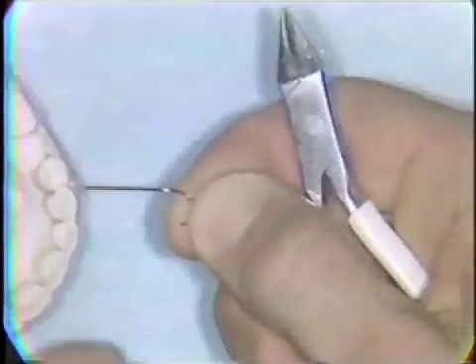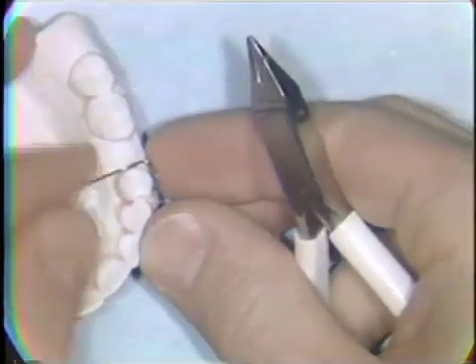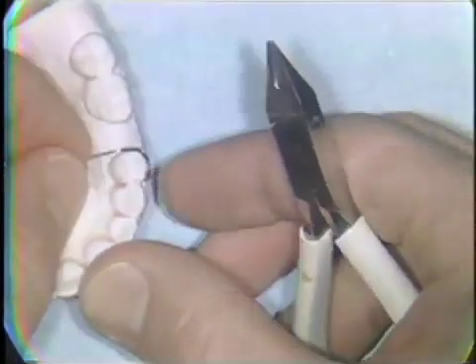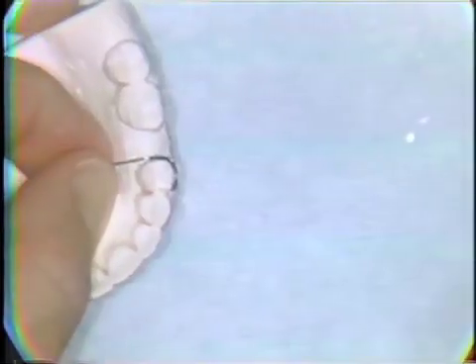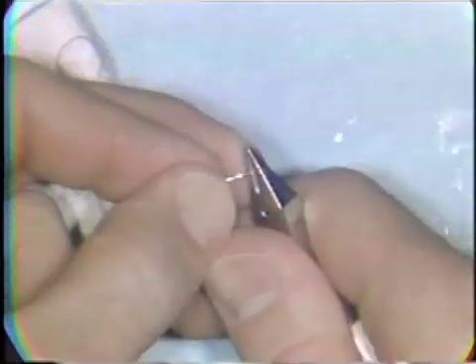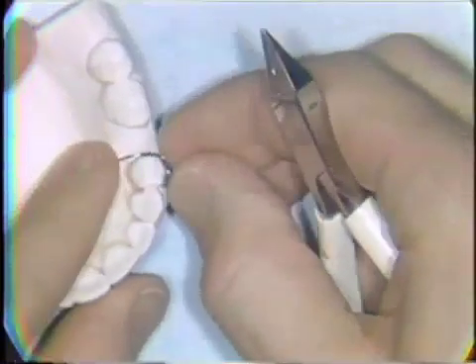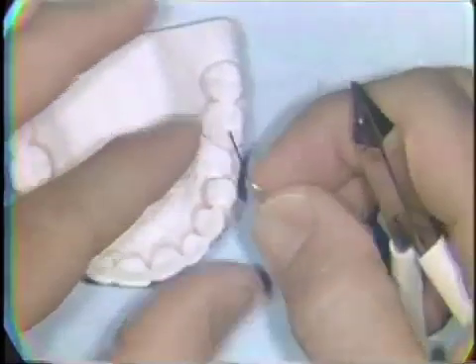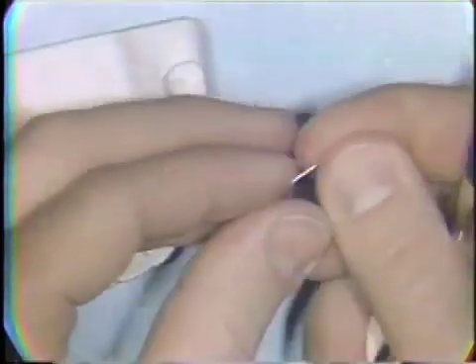You have to try it back on the model several times during this procedure to be sure that each bend you've made is correct. The wire should be adapted to be about a millimeter off the palatal tissues. A small loop for retention in acrylic is bent into the end of the palatal extension of the clasp wire.